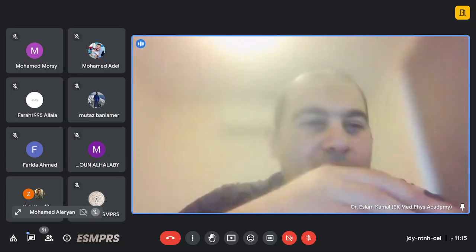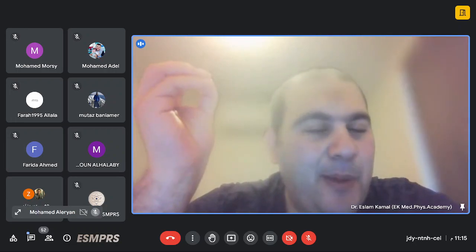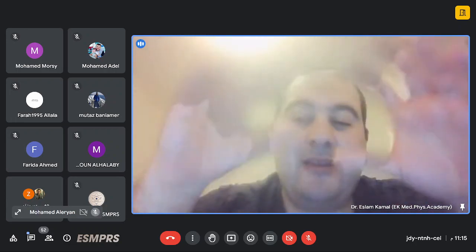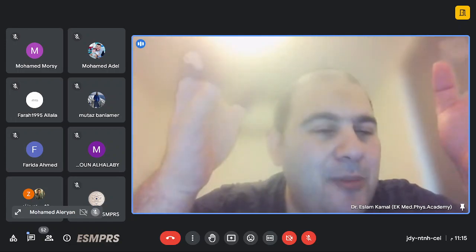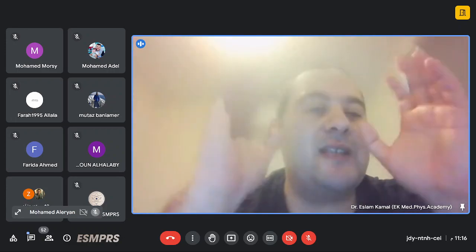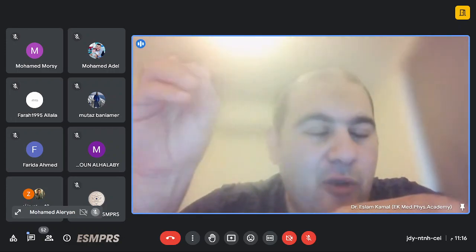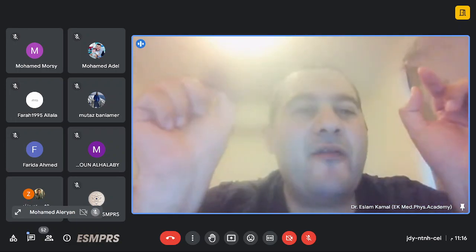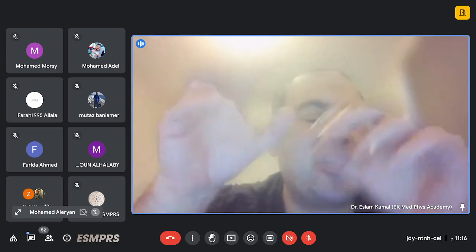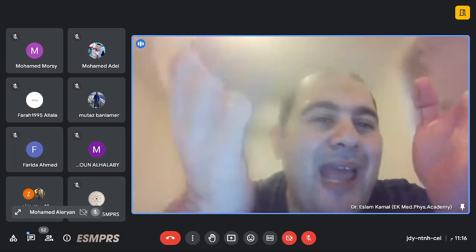الفرق ما بين الاثنين ايه؟ ال 180 ديجري بالز. حضرتك بتدي 90 ديجري بالز، تنزل البروتونات في الاكس واي بلين، يحصل لها الديفيزنج، تقوم مدي ال 180، ال 180 تعمل فليبنج للبروتونز وتعمل ريفوكسنج بالز. فسموا السبين ايكو لان هذه الايكو معتمده على الريفوكسنج اللي حصل او السبين موشن، انك غيرت في السبين دايركشن او الدايركشن بتاع البروتونات اللي حصل لها ديفيز وخليتها كلها ان فيز.